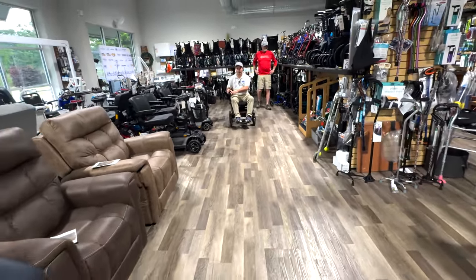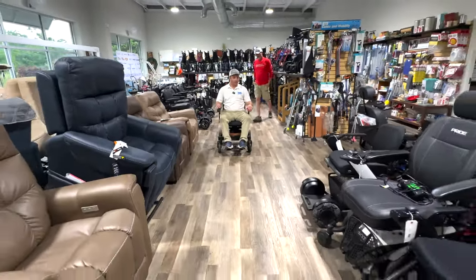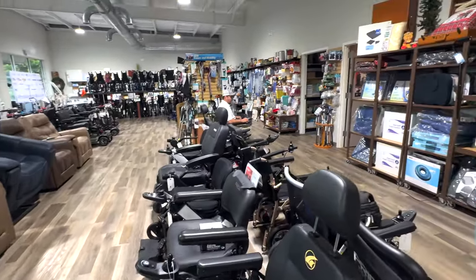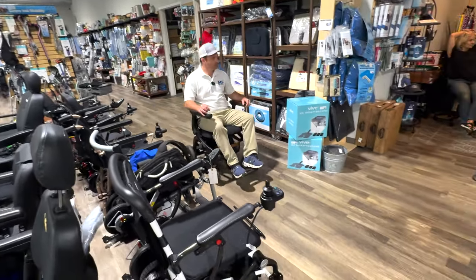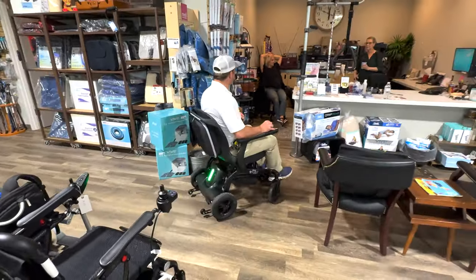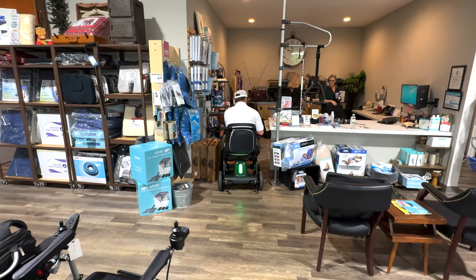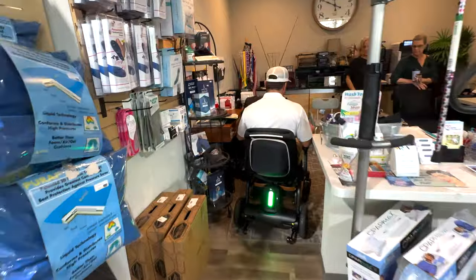So we're inside a store, just so you know, this is a small store. If you go to a grocery store, you don't have to worry. Look, you can maneuver it. Let's see if I can get to the back here. Can I slide through here? Excuse me, please. I'm going to turn it down so I can get through a tight space. And let's just come back here.